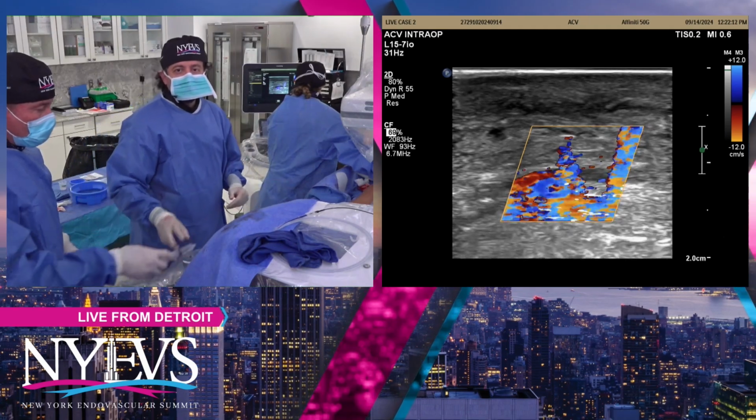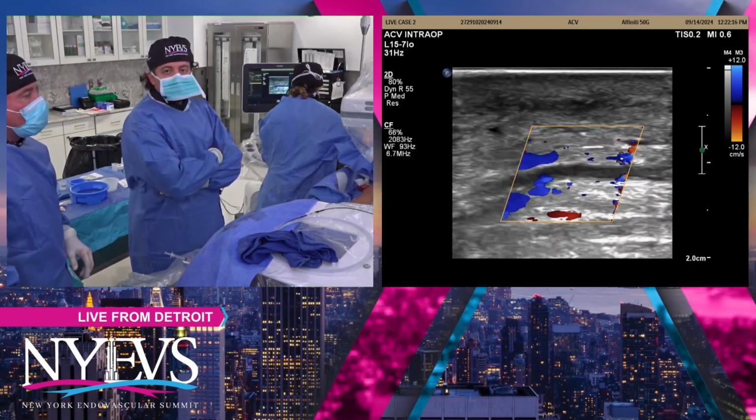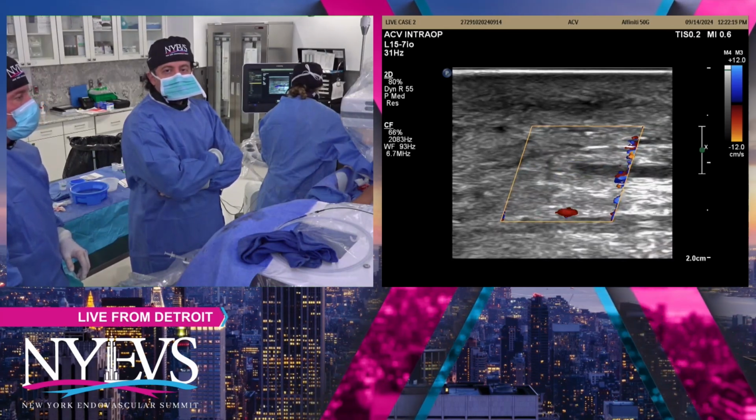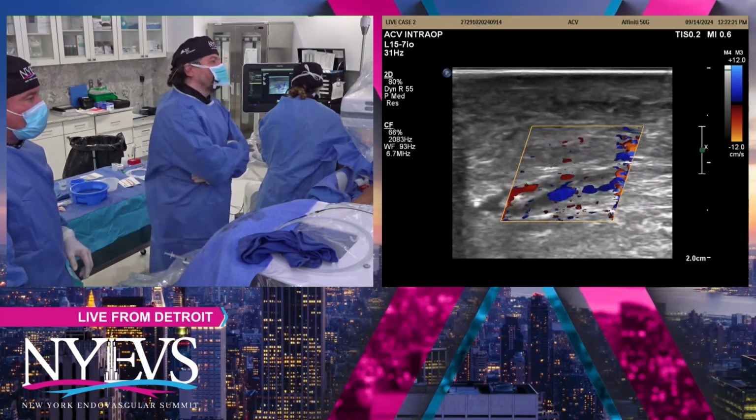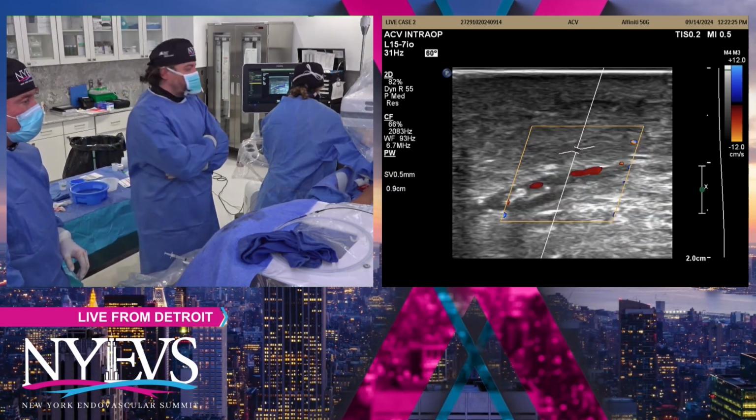Fadi, as you do the ultrasound in SpeakAid, just a question. How did you size that balloon? Did you IVUS it, or do you have an algorithm for sizing balloons in the loop? Because it obviously takes a lot of experience. Yeah, that's a great question, PK.